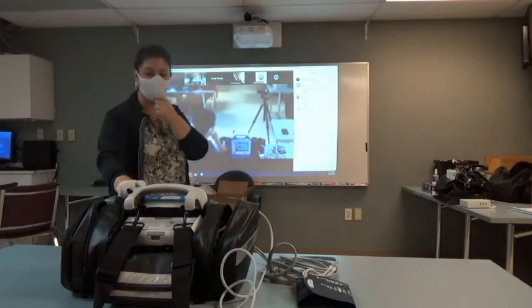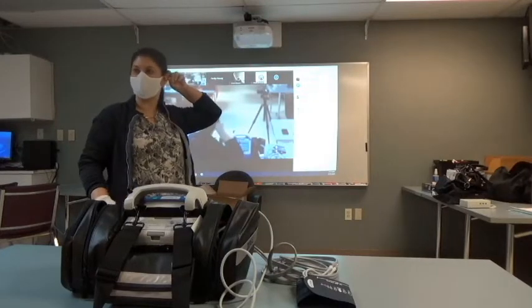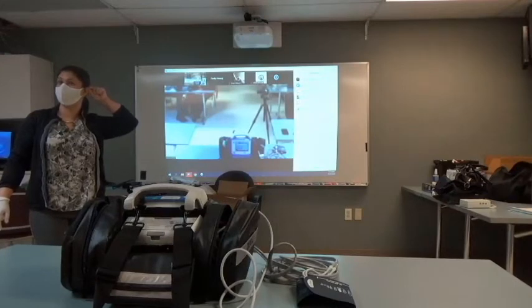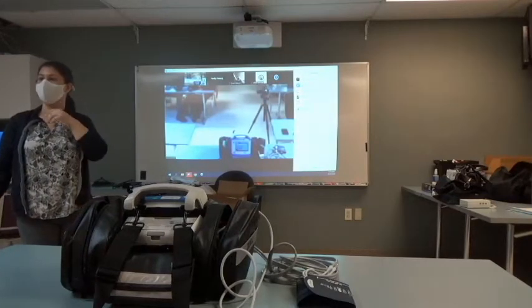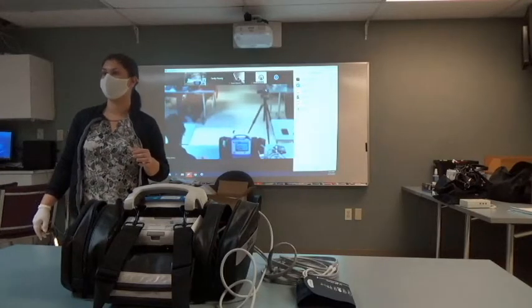And now you can scroll one down to the interval, press enter, and you can select how often you would like your blood pressure readings. 1 minute, 5 minutes, 15 minutes, whatever you guys like.